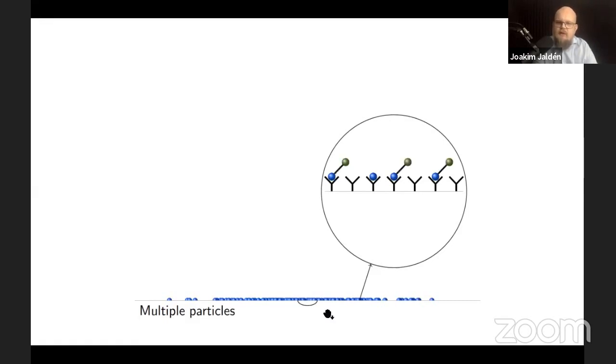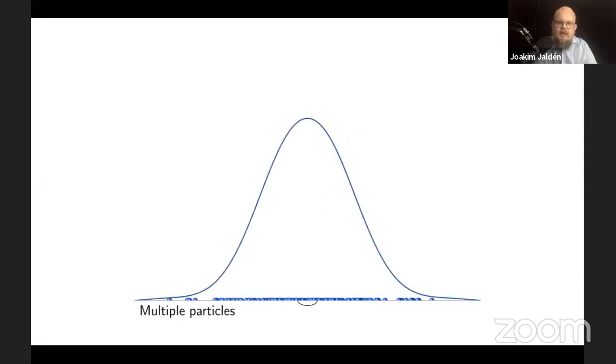Then to each one of these cytokines, you attach the fluorophore. You excite it with some light of a certain wavelength, and you get the fluorescent response. And this allows you to take the picture, which allows you to essentially image the density of bound particles across this membrane. And this is how the data is formed.